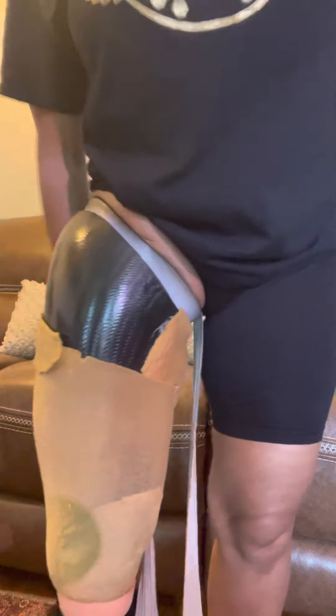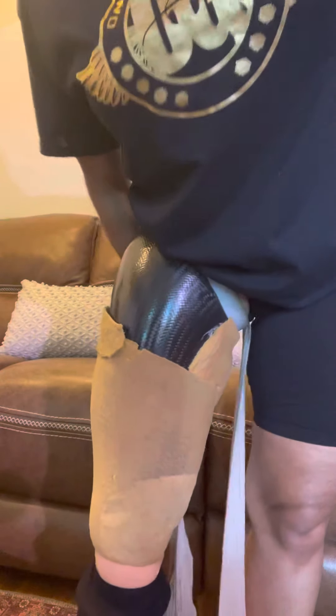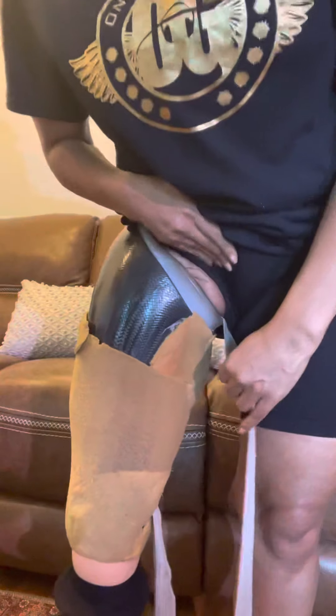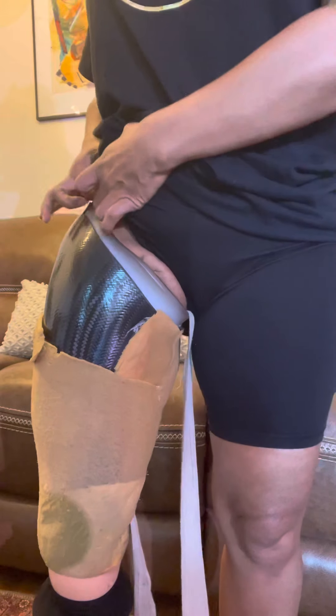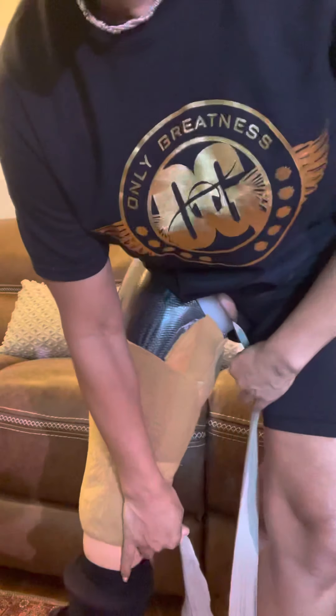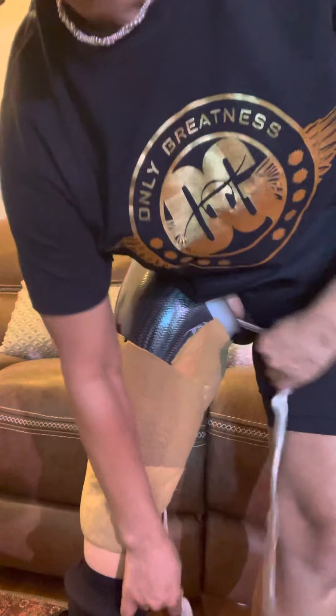Put my leg in there and kind of just wiggle it around to get positioned. I'll get the camera to the back so you can see. This is how I do it — I start here on the side. You see that tissue? I'm going to pull all of that in. Make sure you can see it — all that tissue has to go in. You just start pulling this down and maneuvering it around.